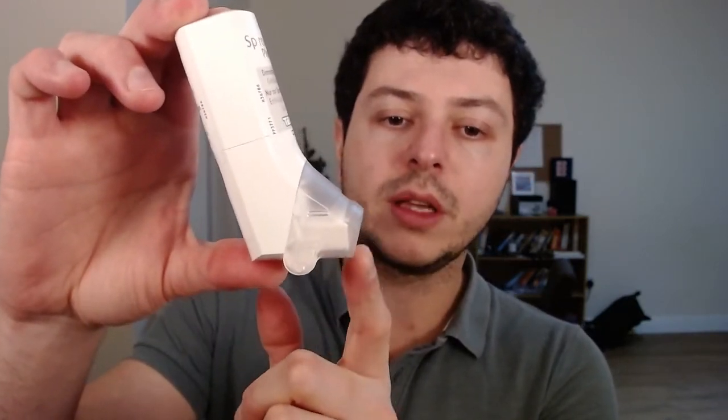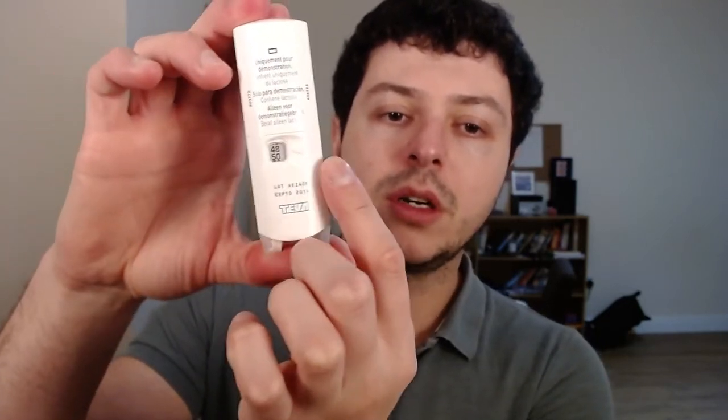So as you can see, this is how the inhaler looks. It has this transparent cover that hides a little mouthpiece inside, and on the back there is a dose counter.